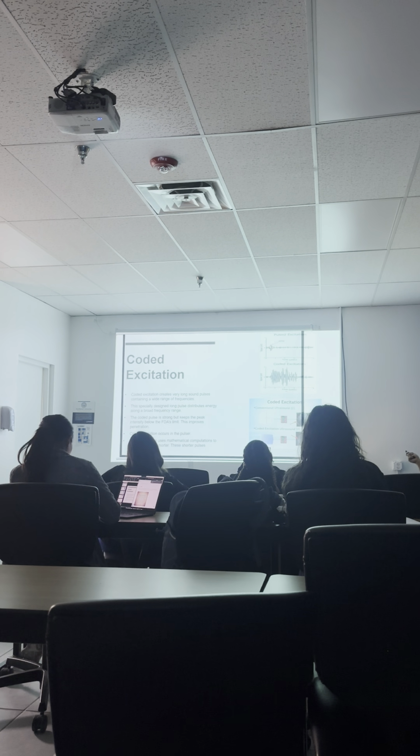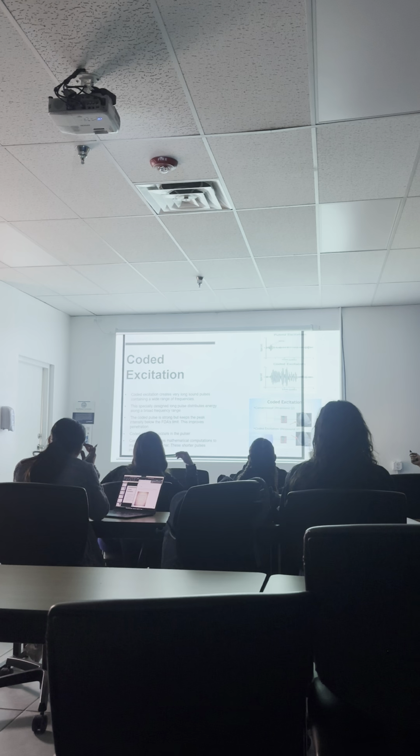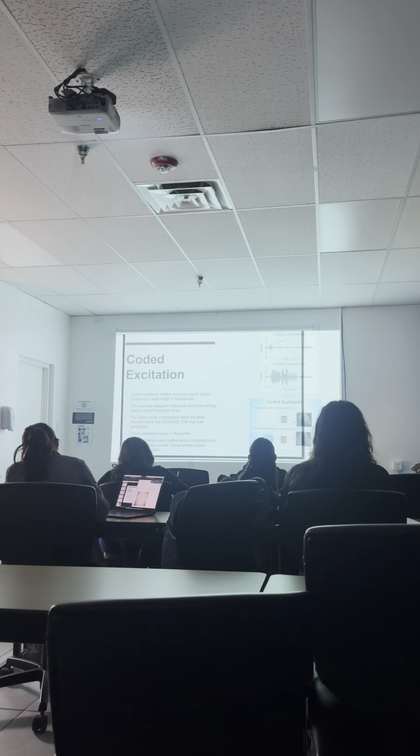Okay, so we have one inclination and one declination here. How many inclinations and declinations do you see here? A lot more, right? What about the time? It was faster to process the top one. So we can say that the top one has a short PD, right? What about the bottom one? A longer PD, right?